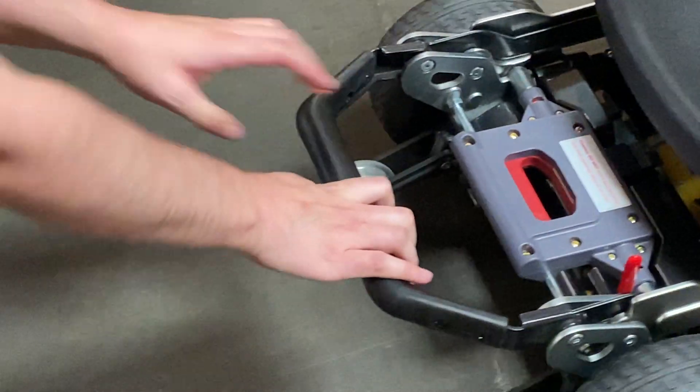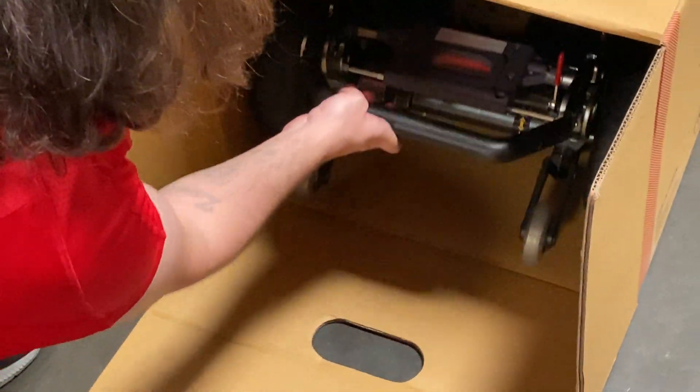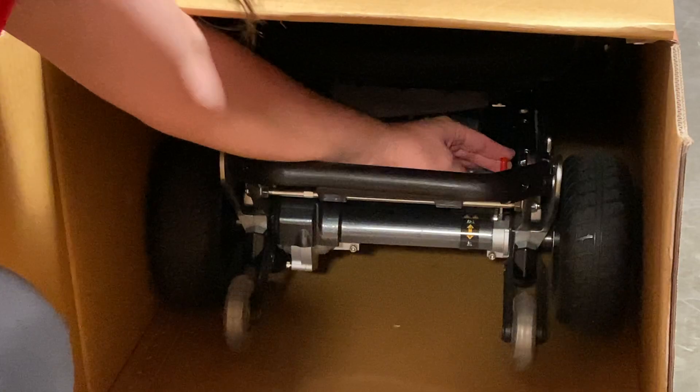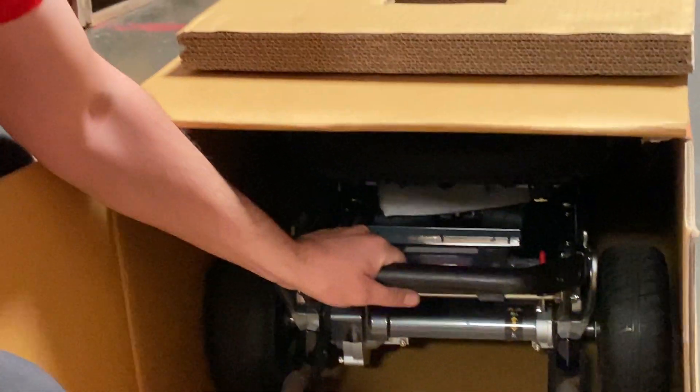Roll your scooter right back into the box. Remember, the scooter goes back in the same way it looks on the side of your box. Then pull back on your brake engage so the brake is engaged and the scooter won't slide around or move.